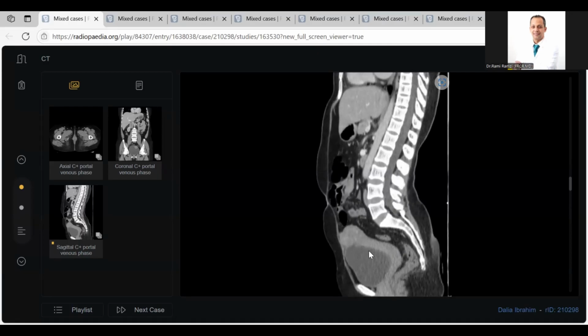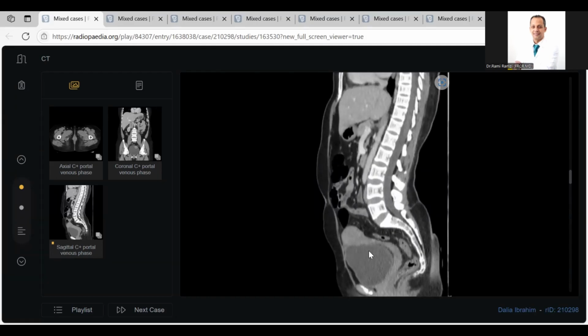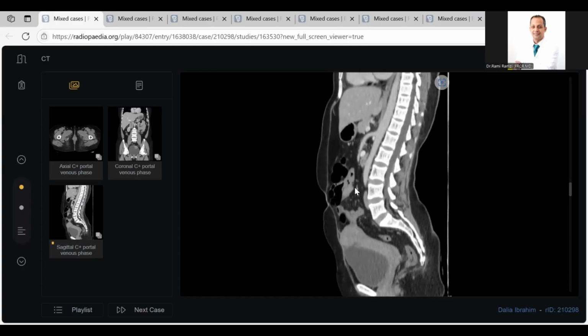The gynecologist wanted more confirmation for medical legality. Do you, sir, have any single spot clue from the same scan? Yes, sir, I can do a single spot film of fluoroscopy to see the fistulous communication. By CT, I can retrogradely fill the bladder with the help of a catheter, clamping the catheter, and inject the contrast and see the communication and the passage between the uterus and the bladder.